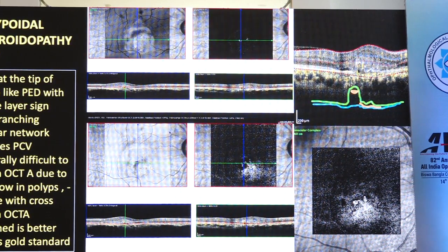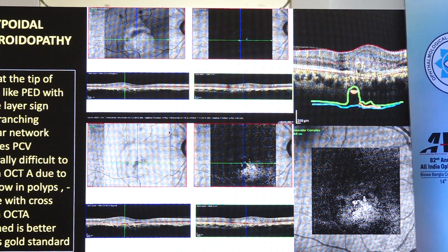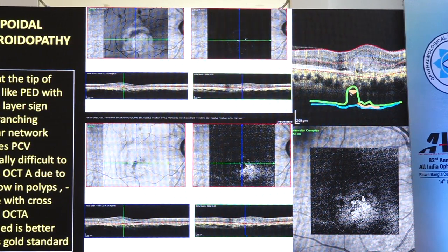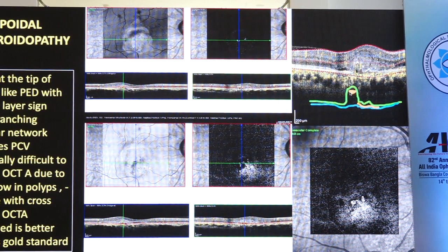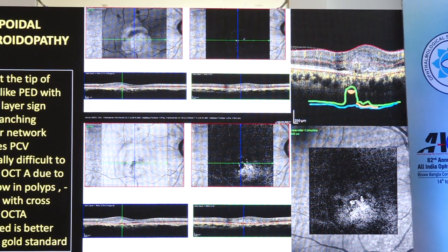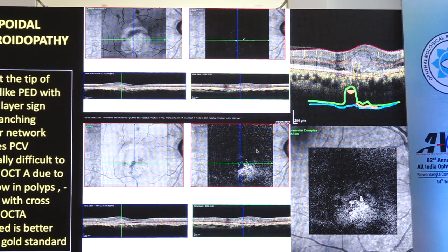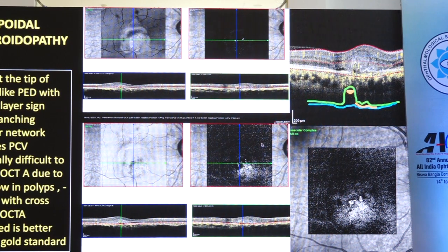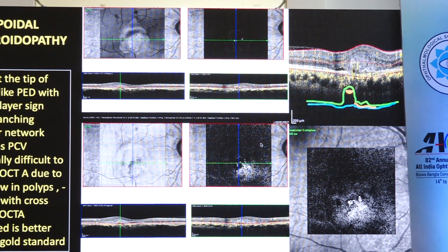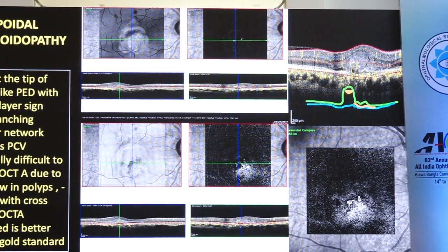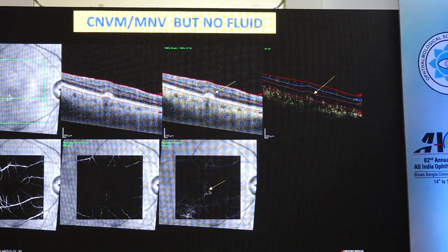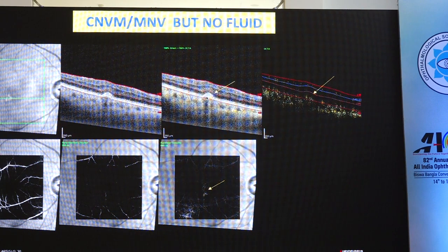Generally it is difficult to pick up this flow in polyps because the flow is not much in these lesions, but if you carefully look at the cross-sectional OCT along with the en-face images, you can detect this flow in many of these patients. Although the gold standard in these patients is still ICG angiography, there is one patient where there is a flow present in this lesion but there is no fluid.